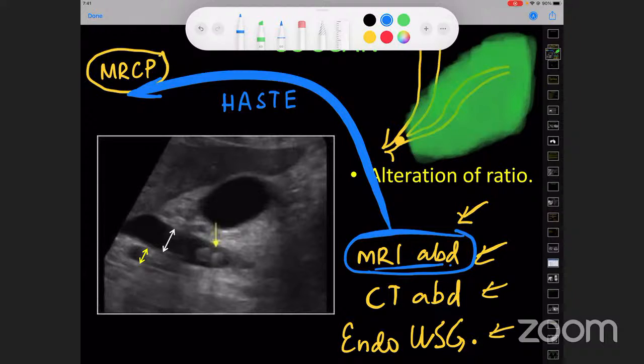Okay. So basically, the MRCP in an early stage can give us an idea whether there is any stone obstructed at the ampulla, isn't it? But in the true sense of the term, in pancreatitis, you get the necrosis only after the 3rd or the 4th day, isn't it? So on MRI or CT scan, without contrast, we could see the morphology, whereas on ultrasonography, we could only see the bulky pancreas or hypoechoic pancreas.